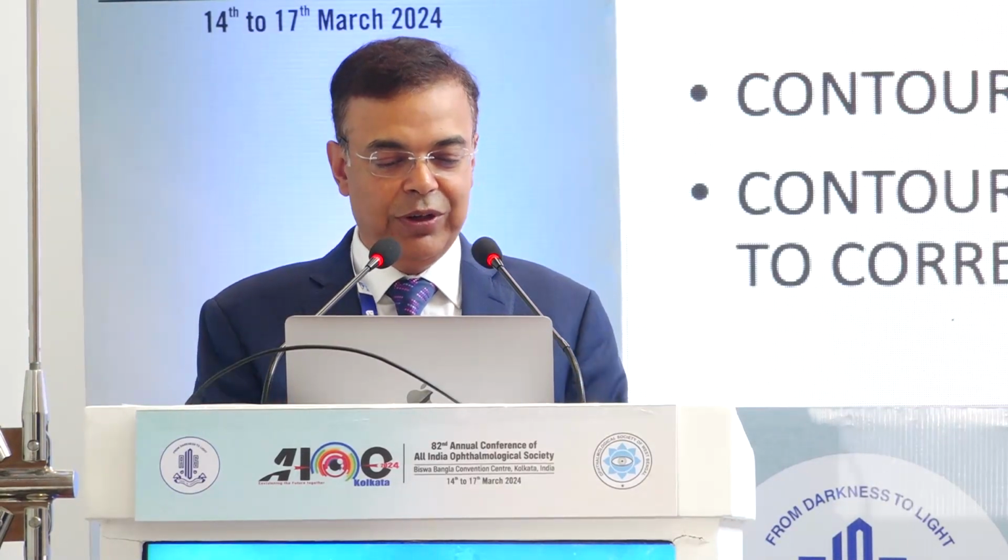So Contour, as we all understand, is representing the shape or form. So that's what we are doing with Contoura LASIK, trying to correct the topography of the cornea by doing a topography guided treatment. And I'm sure that if we have all refractive surgeons sitting here, they would be aware of the fact that we do wavefront optimized as one of the most predominant forms of laser correction. And then, many years back, wavefront guided treatments took fancy for all of us. And somewhere way back in 2005 or 6, we all started playing with aberrometry-assisted treatments with wavefront guided treatments.